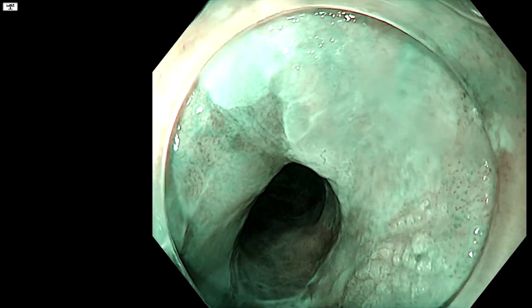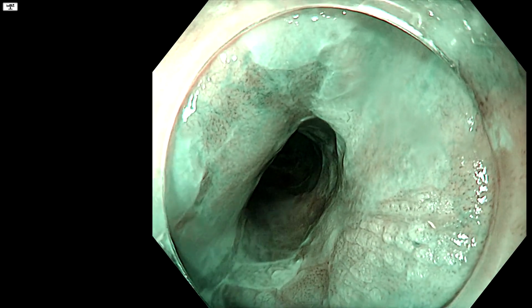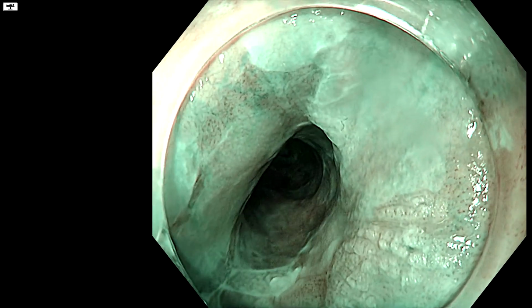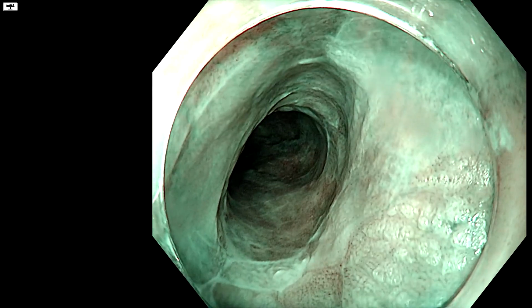So I'm going to mark it now, which is probably interesting for you to watch. So where I think the abnormality is, and then we're going to put Lugol on after that. So that's Lugol's iodine, a way of highlighting squamous dysplasia. We're going to put that on afterwards to confirm whether or not our marking is right.